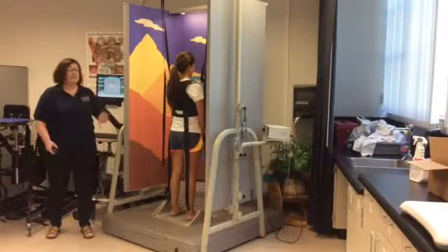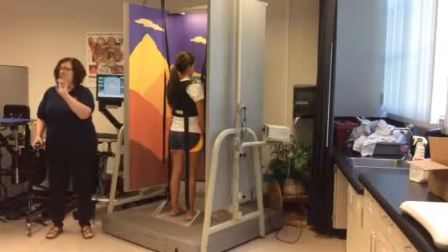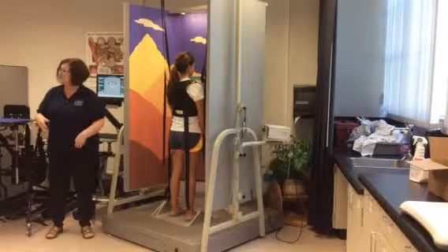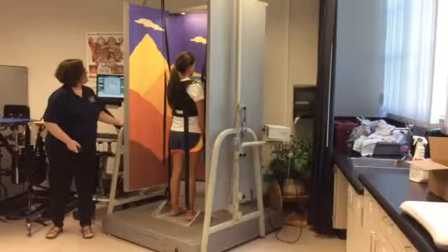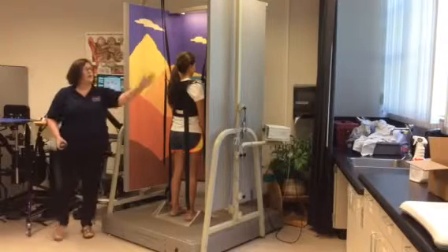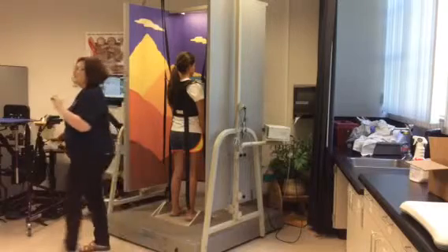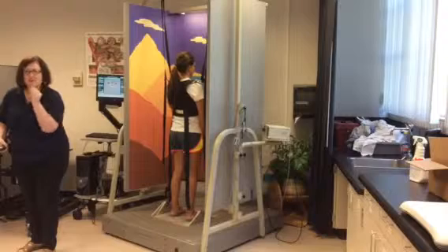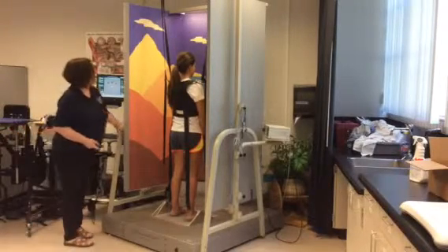And so I am going to have the floor move predictably in direction, but not in amount. So it'd be something like a sudden pitch on the tilt board that she didn't know was coming. So I'm going to make it variable. And I can also make this move when it tests at 100% difficulty. So when I treat sensory impairment, guess what I can do? Make it 20% difficult.